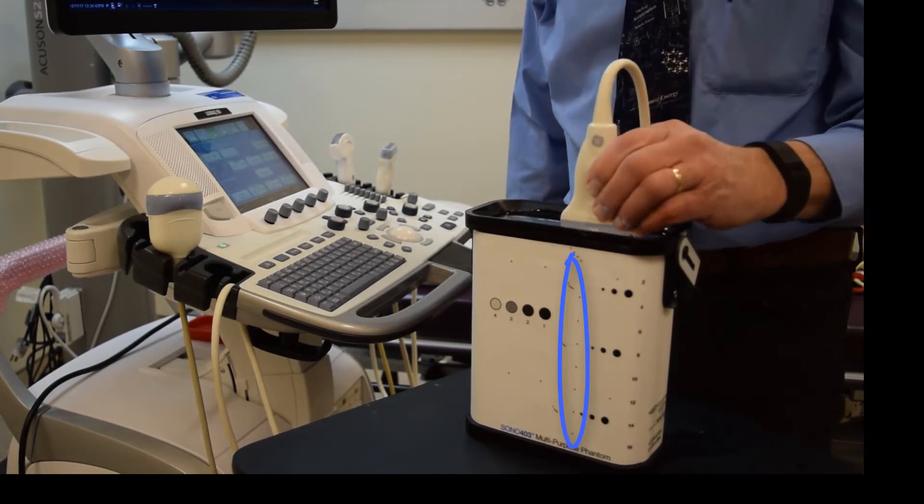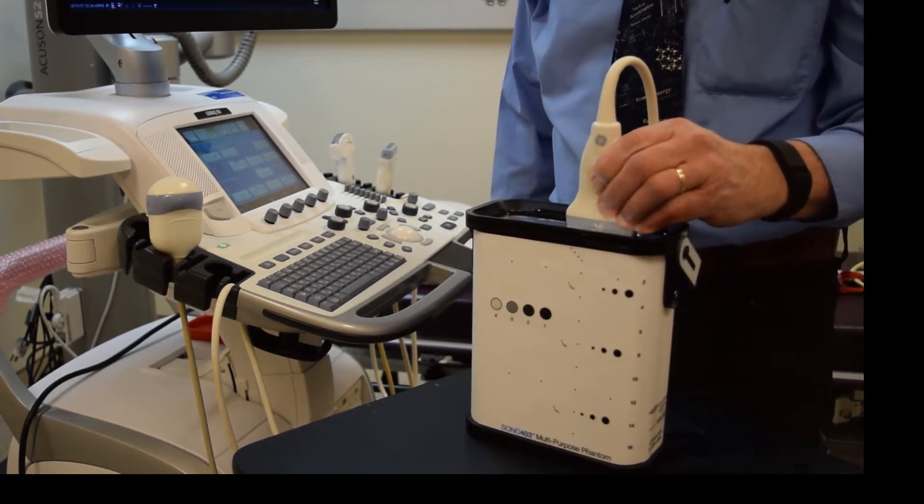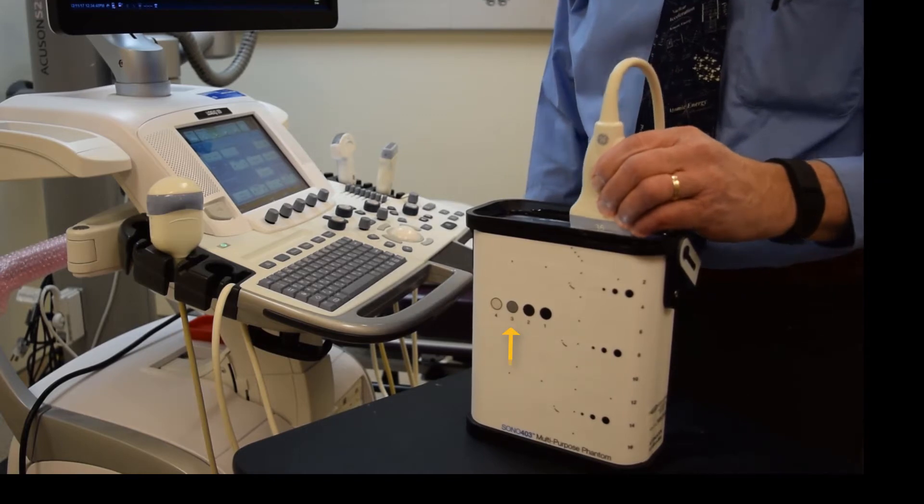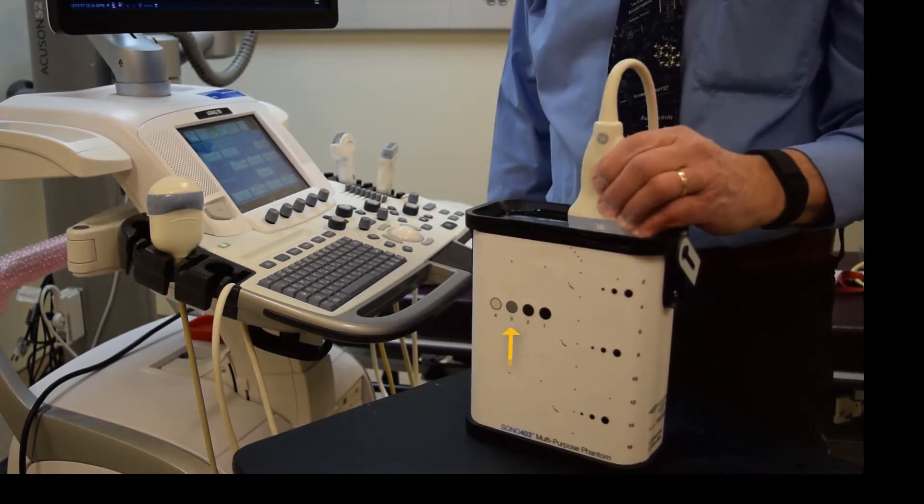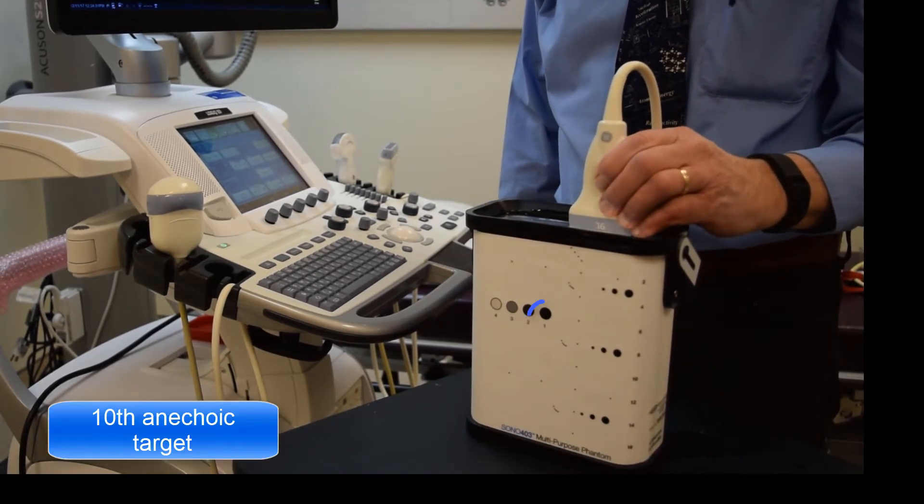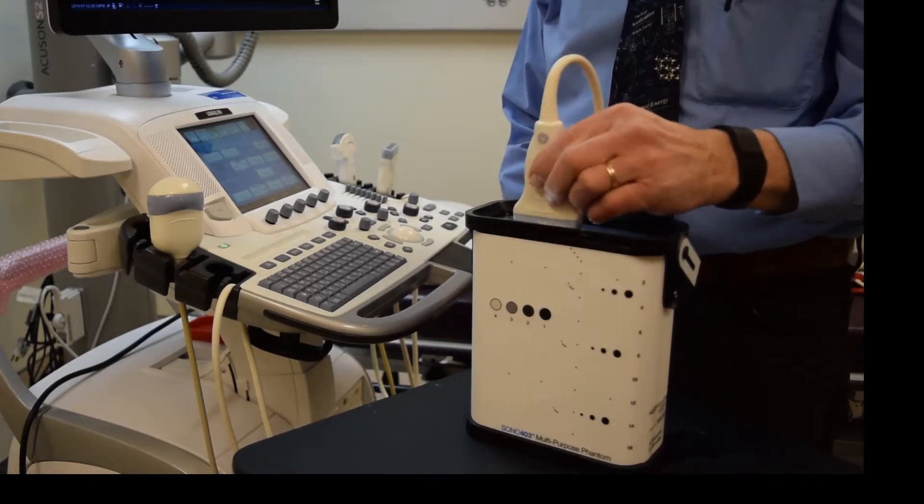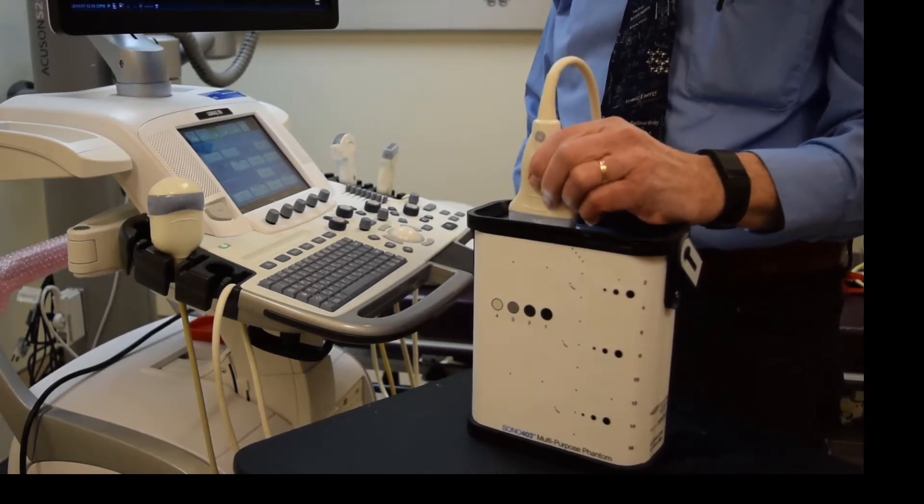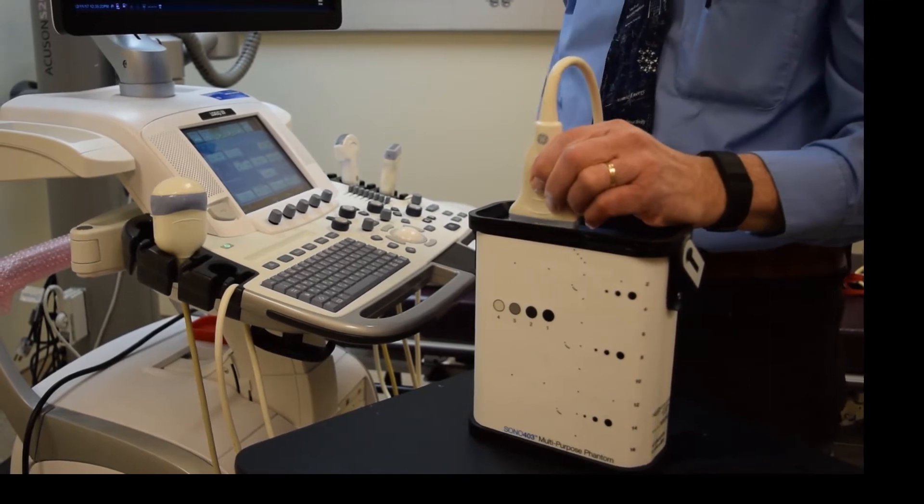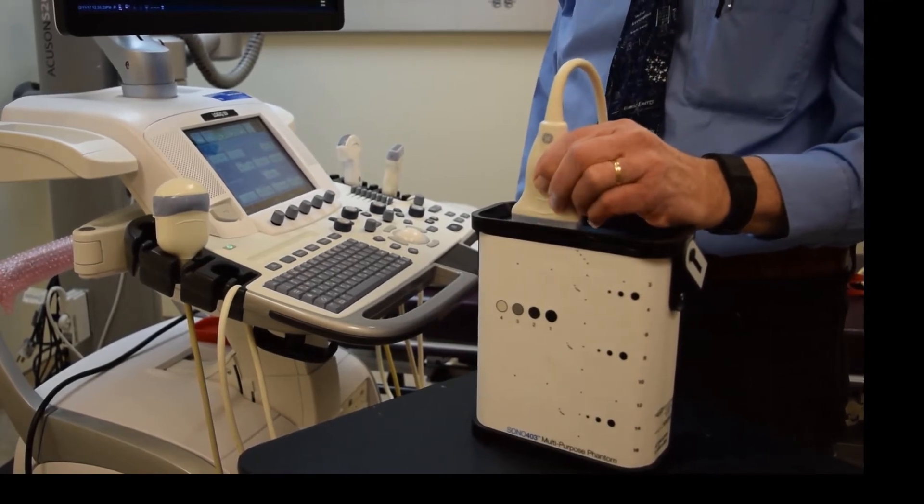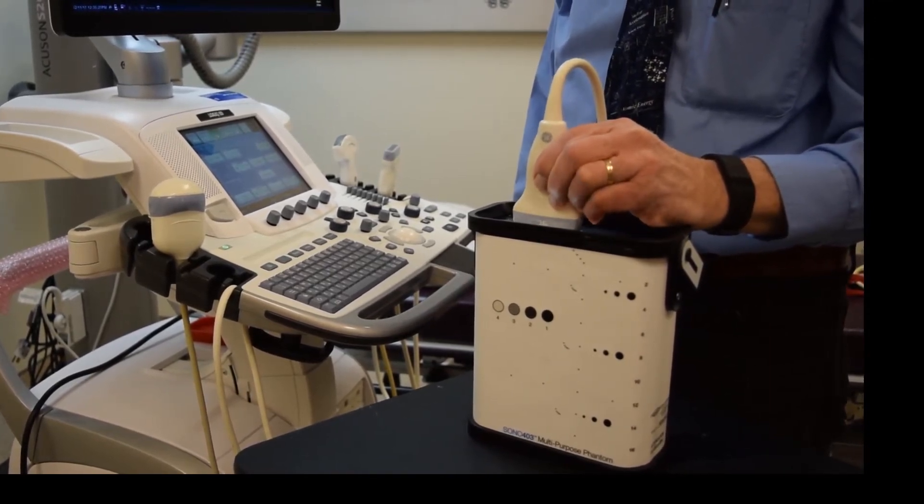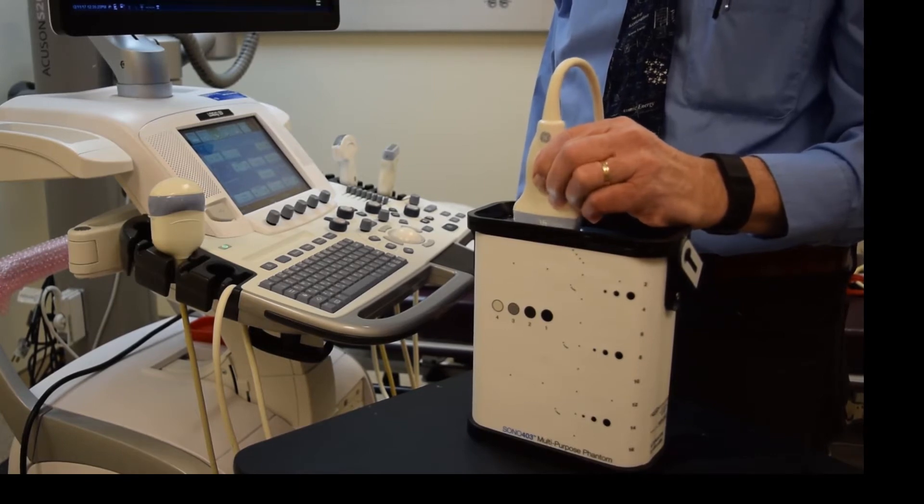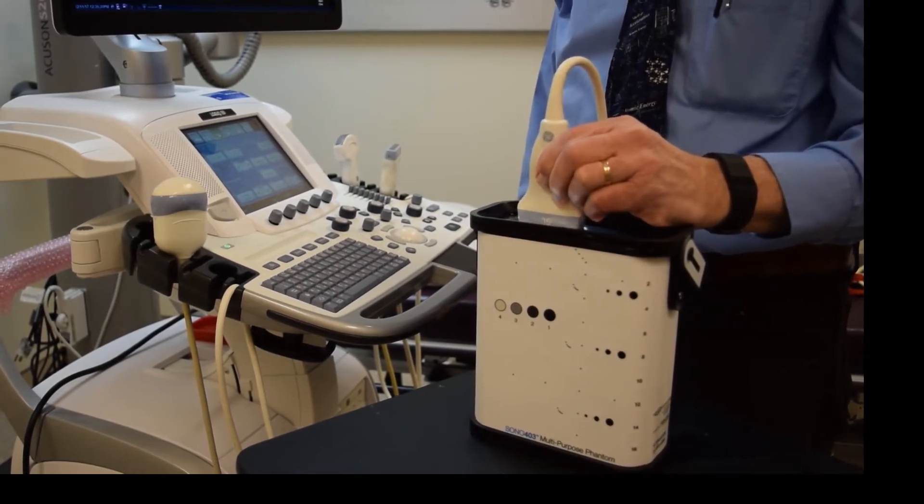And then we have grayscale targets, a high-scattering cylinder on the far left, a plus-6dB one and a minus-6dB one, and another anechoic, a tenth anechoic object on the far right of this set. There are three sets of axial resolution fibers at different distances from the surface of the phantom, and there are horizontal rows of fibers that are utilized for horizontal distance measurement accuracy tests.